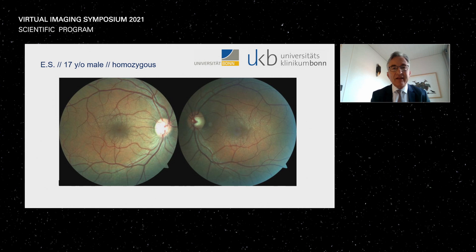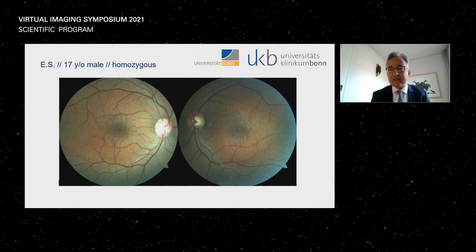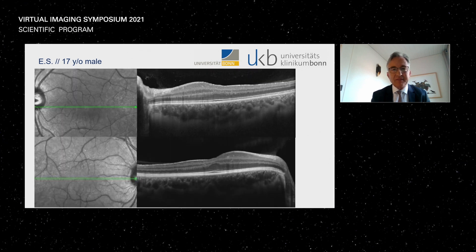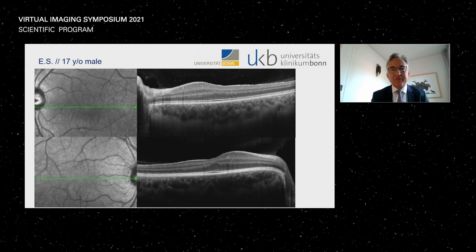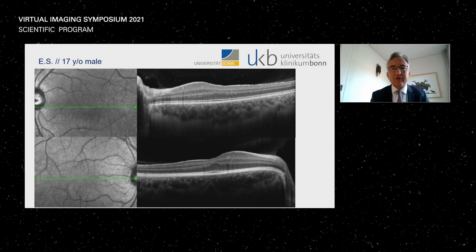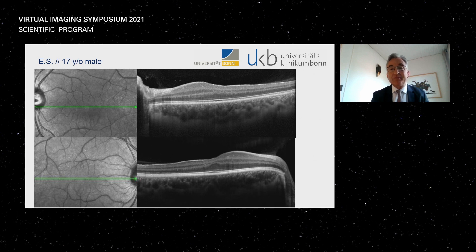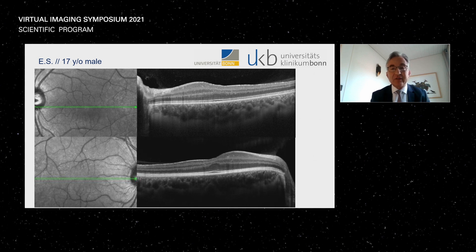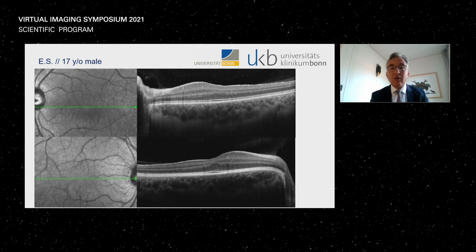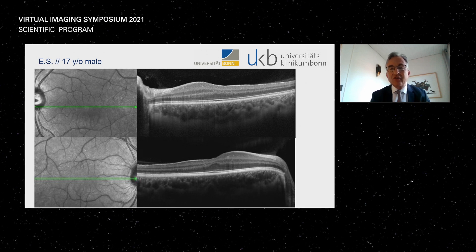Here is a homozygous male, 17 years old — the fundus image looks pretty normal. On OCT, there is the same peculiar phenomenon: a thinning of inner retinal layers temporal to the fovea, an absent foveal pit, and inner retinal layers present at the foveal tissue, while the ONL widening and outer segment elongation look pretty normal.